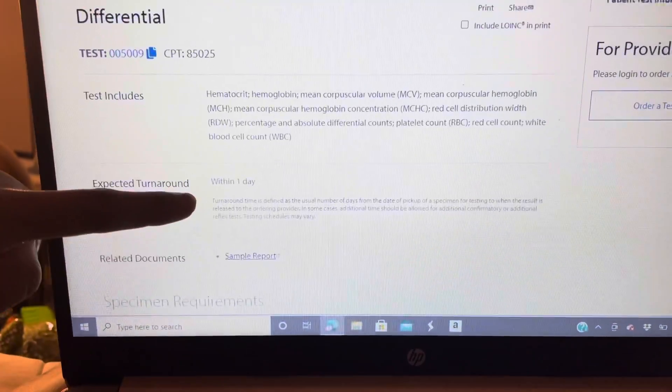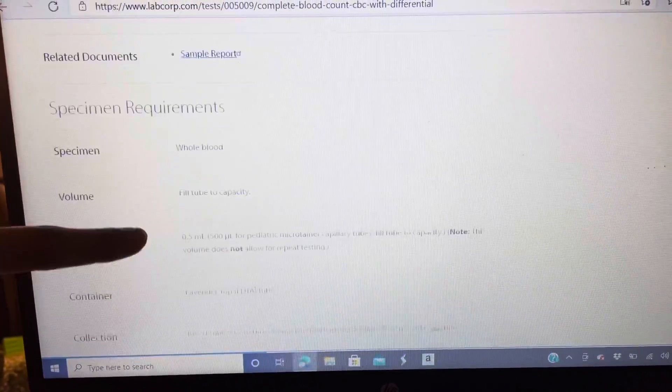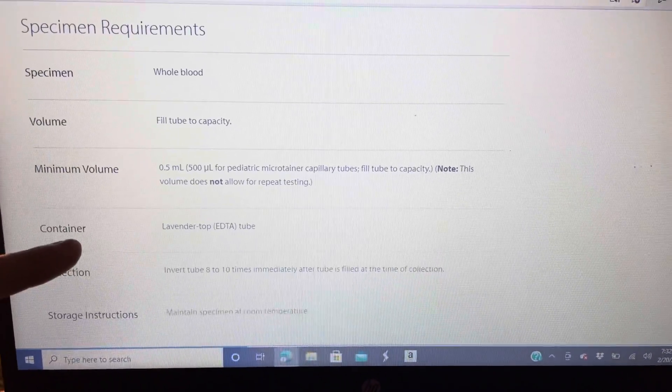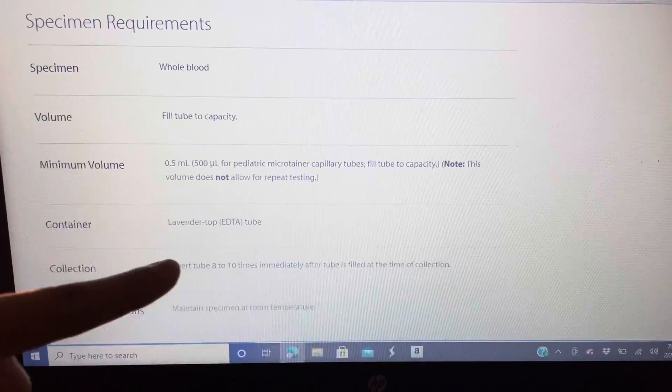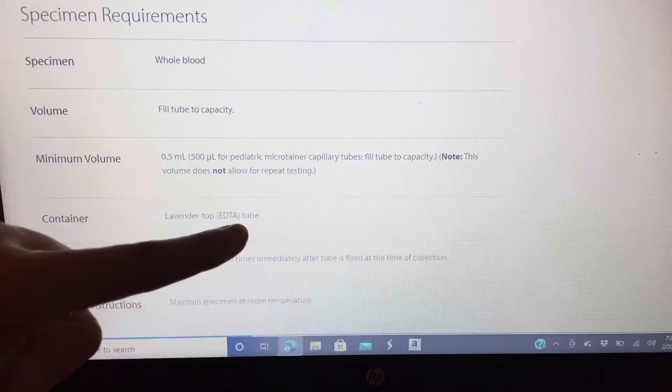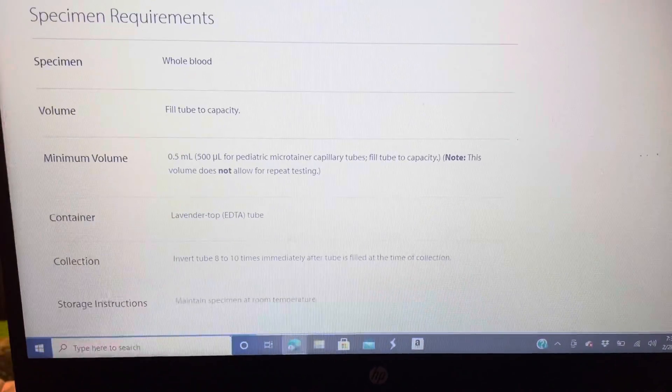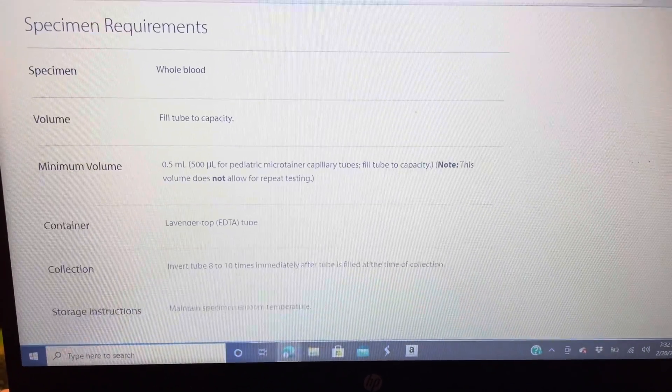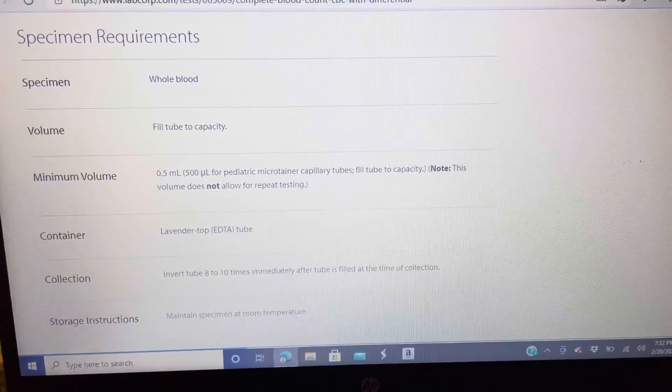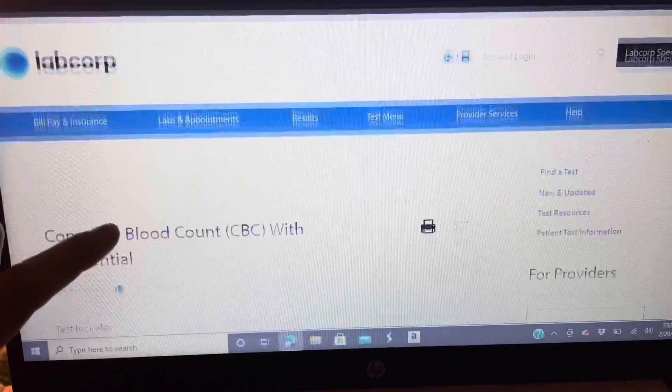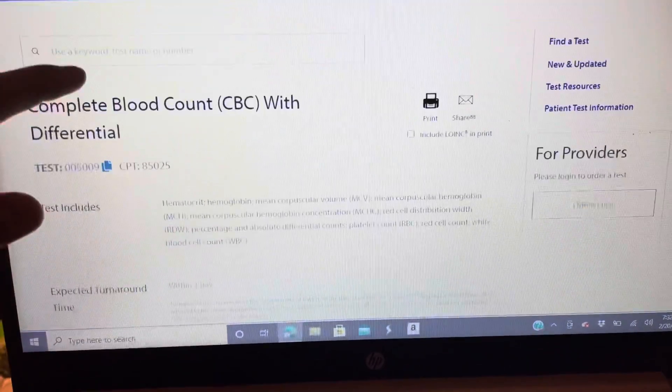We're gonna scroll down all the way to the specimen requirements, container type: lavender tube, EDTA tube. So that's going to be your lavender tube. So we are going to scroll back up, let's do another test.